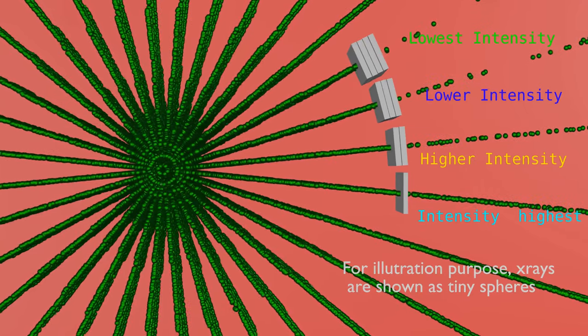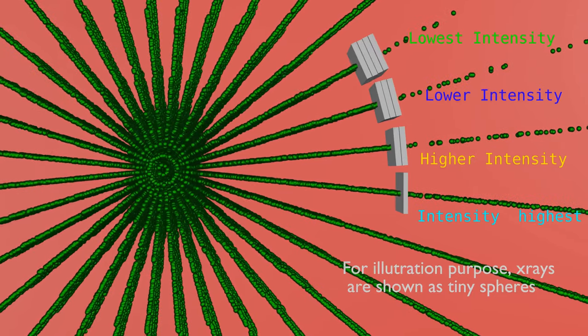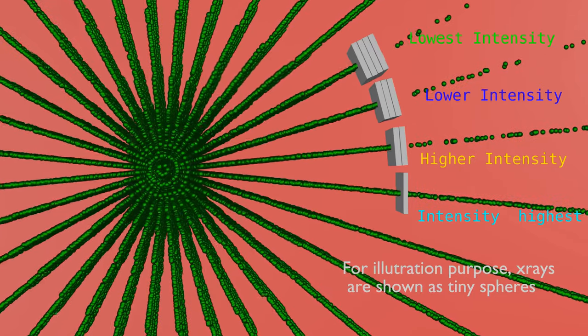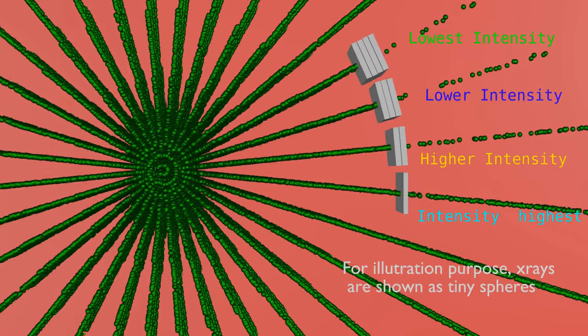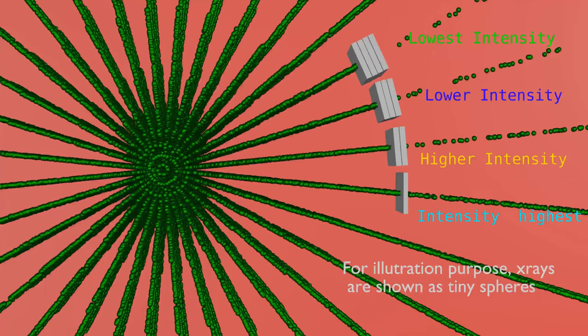So, intensity of x-rays will be lower in the direction of higher thickness. Exactly same thing happens in an x-ray tube, causing intensity variation or heel effect.